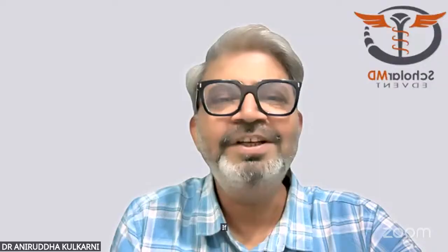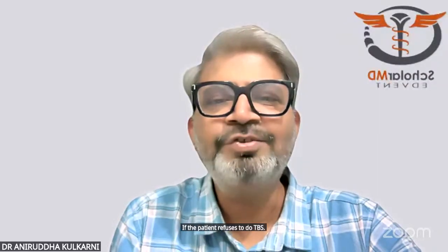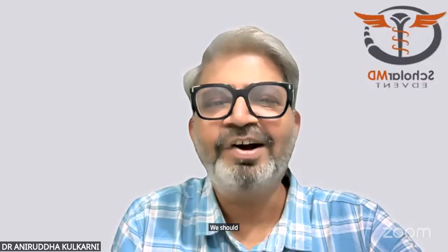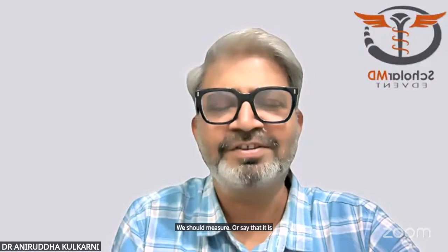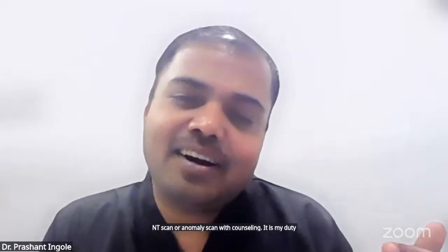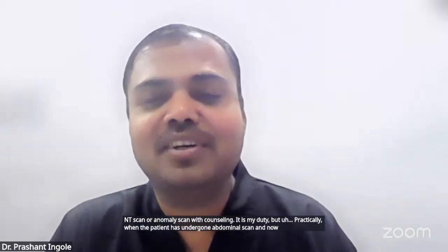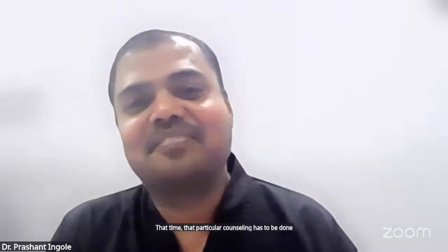If the patient refuses to do TVS, what should we mention in the report? We should say that it is a transabdominal ultrasound. Sir, counseling patients before sending them for such an NT scan or anomaly scan is my duty. But practically, when the patient has undergone an abdominal scan and now has to be taken for a TVS scan, that counseling has to be done by them.